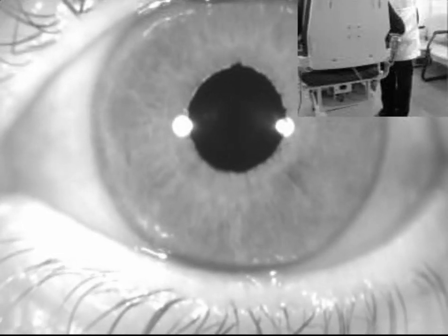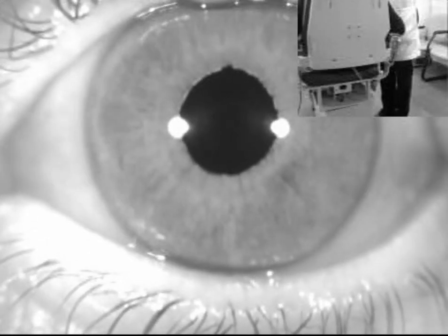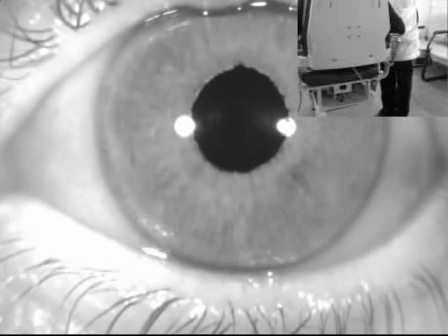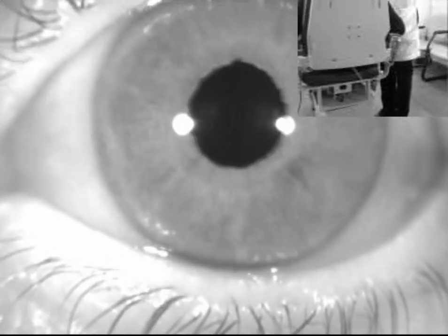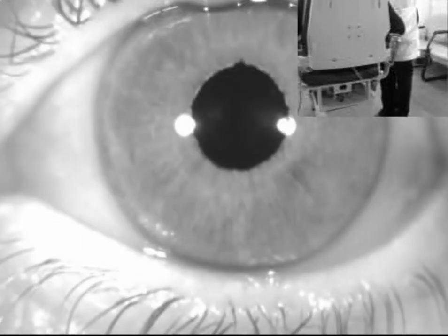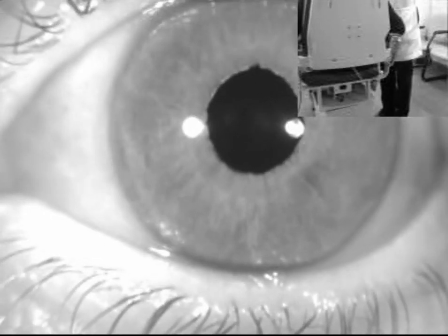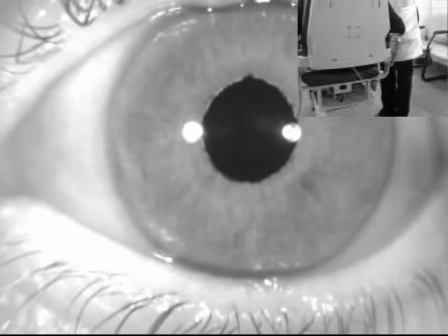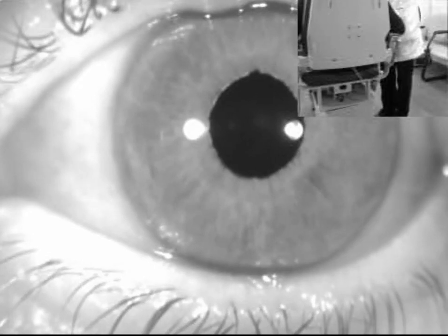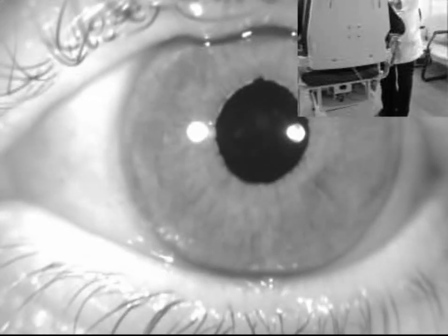This patient has probable left or right lateral canalithiasis — we're not sure. She has no significant nystagmus in neutral gaze. We're going to turn her head to the left side and assume the left Dix-Hallpike position.